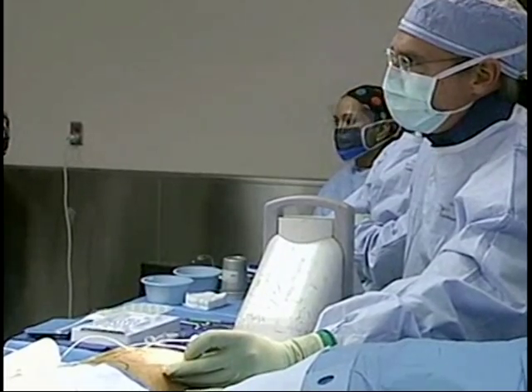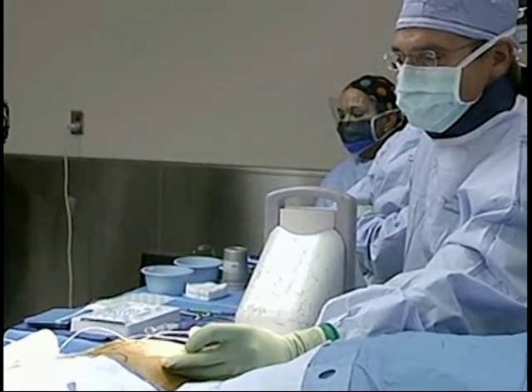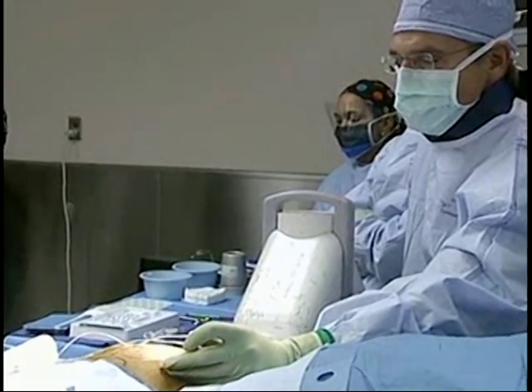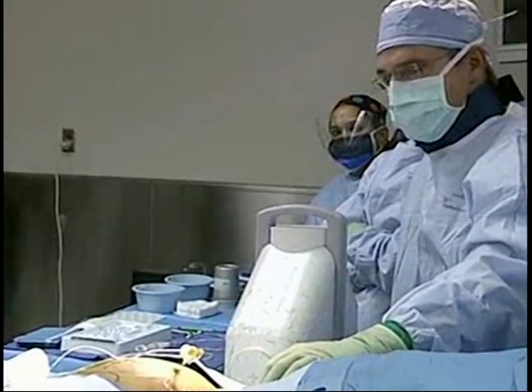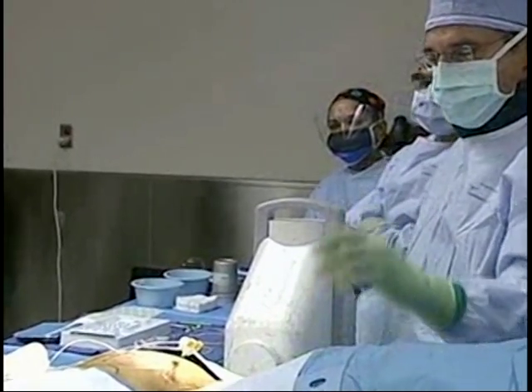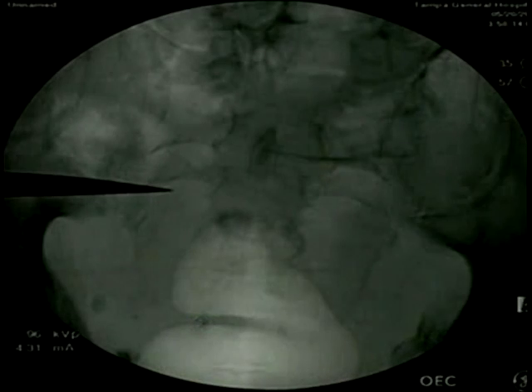What I'm trying to do is place this on the patient's right side. I'm going to take a moment here and change my fluoroscopy image. We're going to go to an AP view to make sure that in terms of my positioning — as far as medial or lateral — I'm where I want to be.